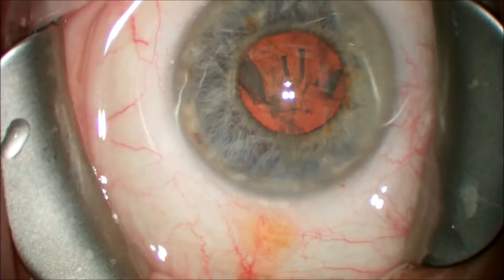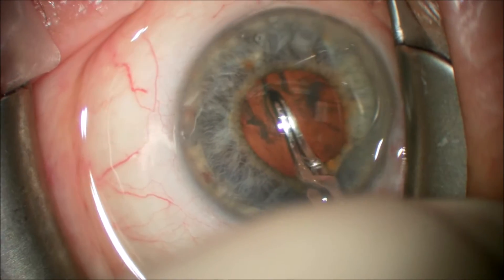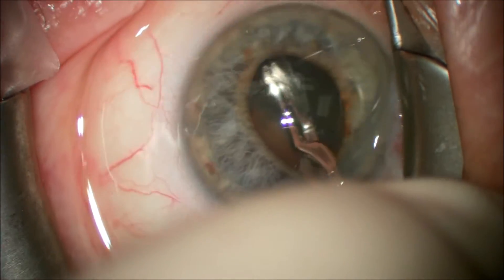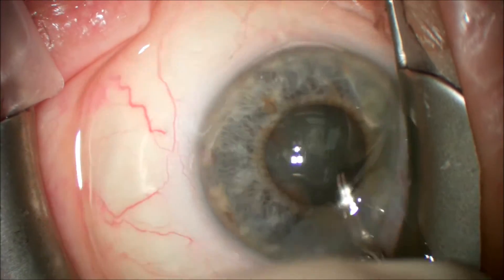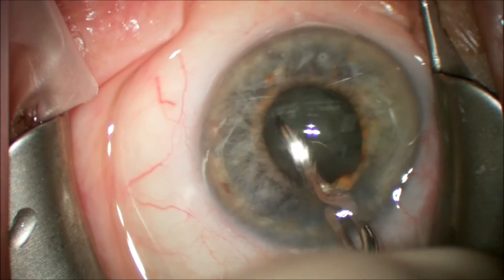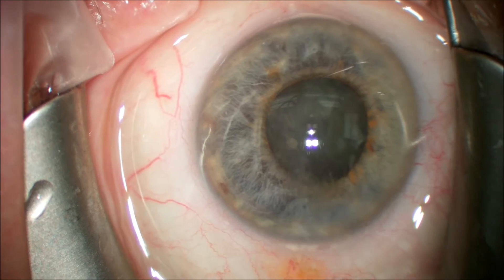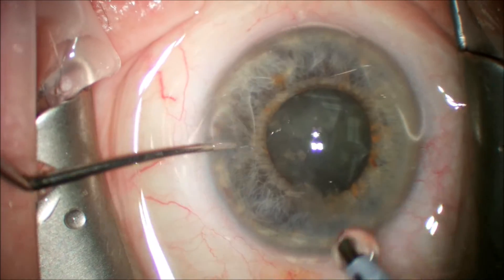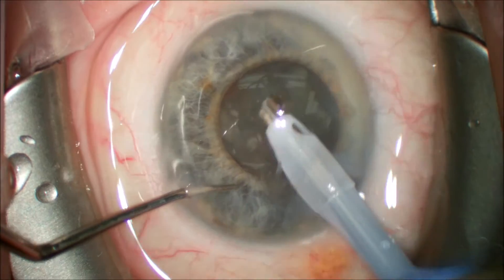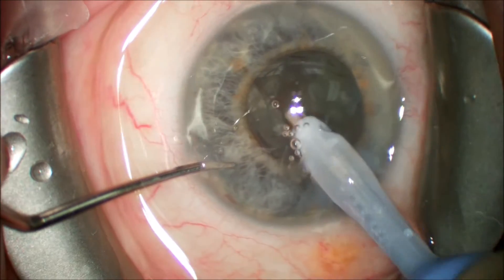It is important to make sure the cataract is free as this will make nuclear disassembly easier in the latter part of the case. We try to break the nucleus into pieces with a pre-chopper but the cataract is too dense to adequately get purchase with the Akahoshi pre-chopper, and at this point we switch to a different nuclear disassembly method. We're going to use divide and conquer and then we will use the Akahoshi pre-chopper as a nucleus cracker by turning it over to the blunt side of the paddles.